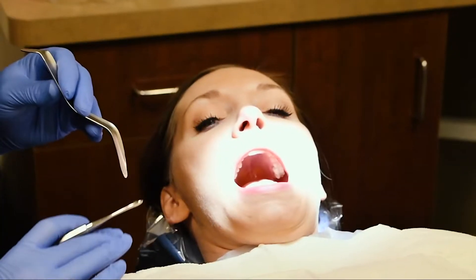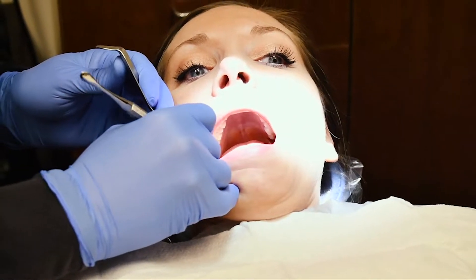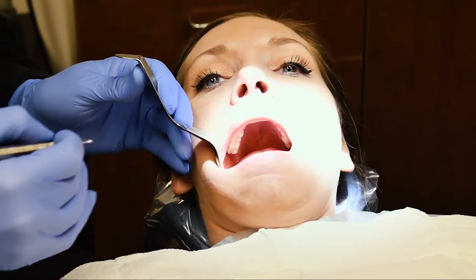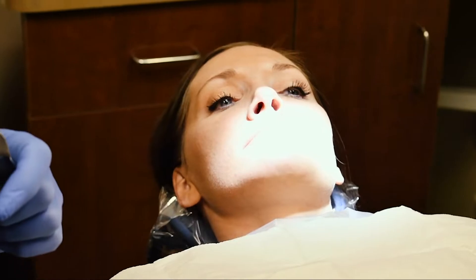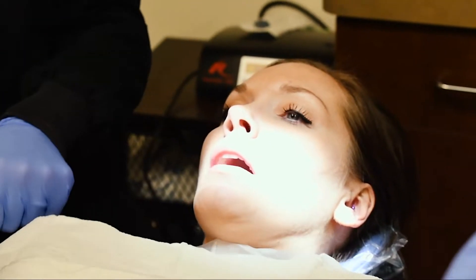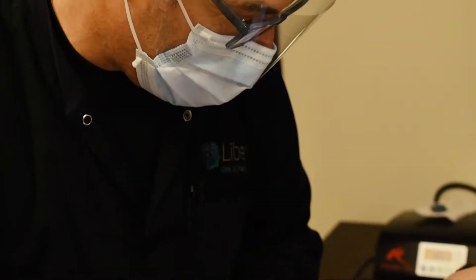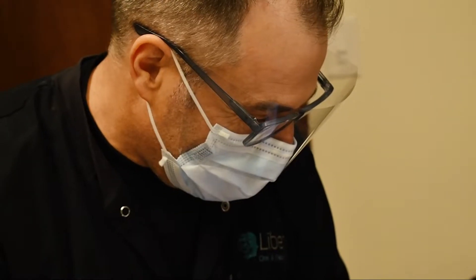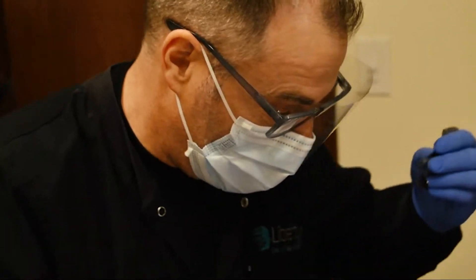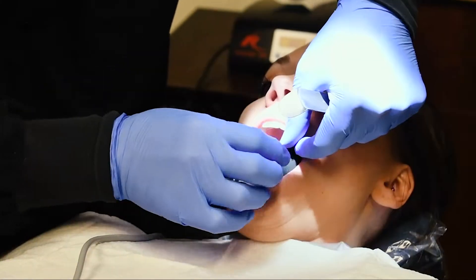I'm just going to touch in the area — just feel a little pressure. Just pressure, nothing more than that. Just let me know if you need a break or anything like that. I have a bite block too — this is usually helpful. Most people like it because it just takes some stress off.